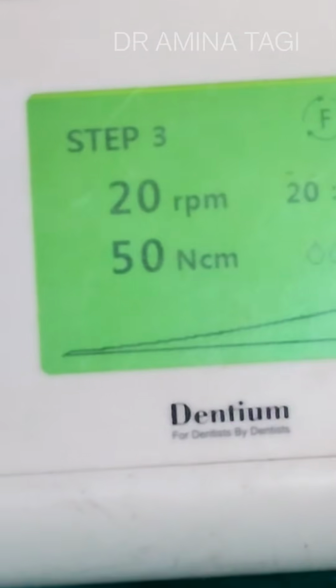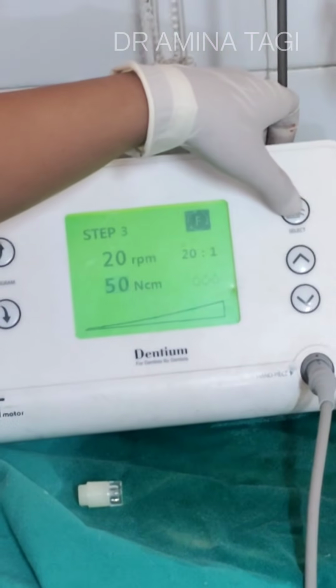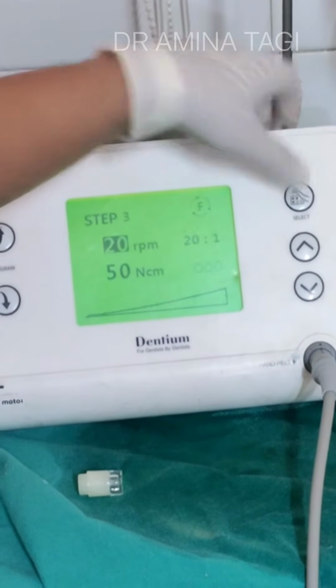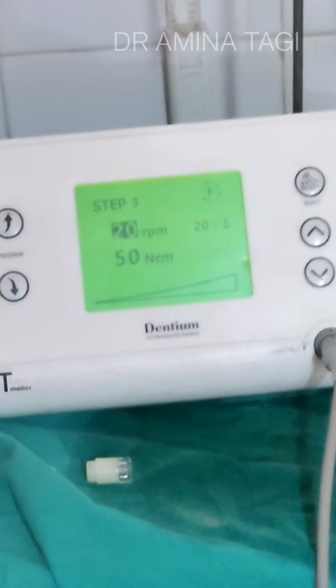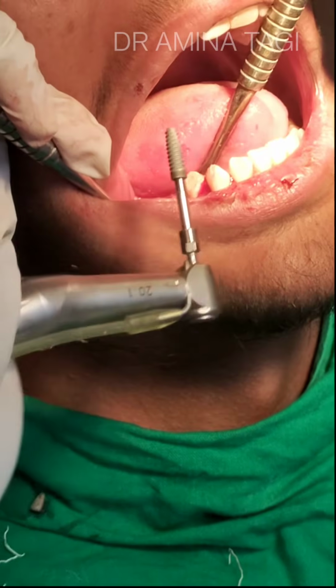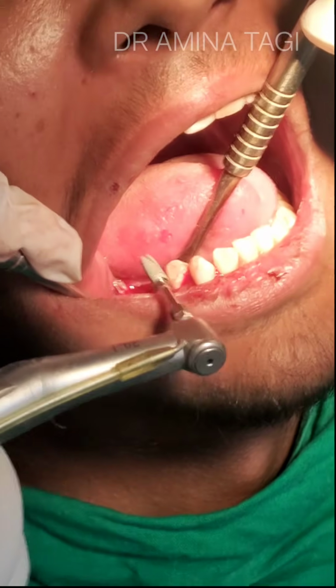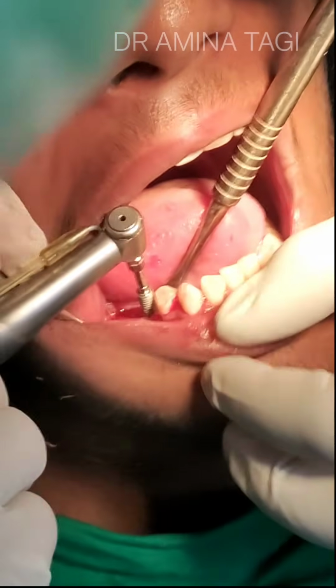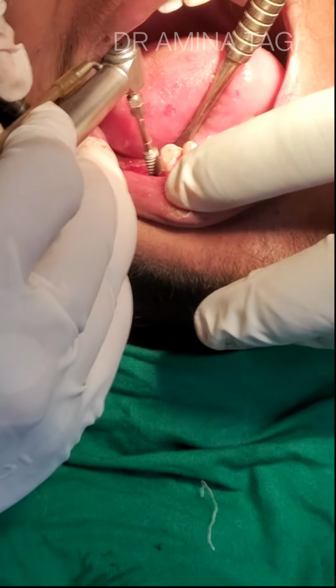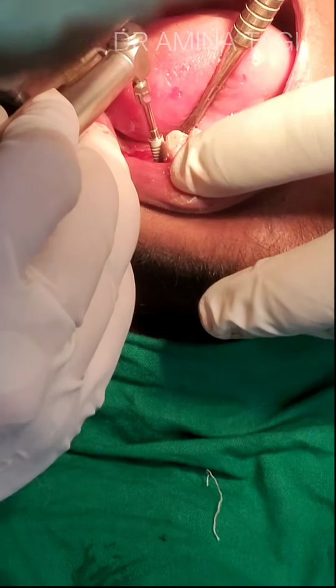Now before placing the implant, this is very important, you need to change the physio settings. So I have taken the RPM as 20 RPM and the torque as 50 NCM. So now while inserting the implant, you just have to follow the pathway that was made by the drill.